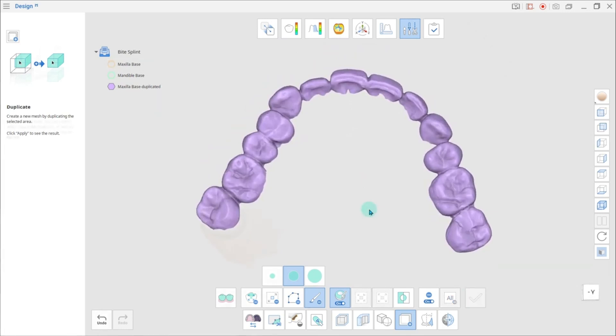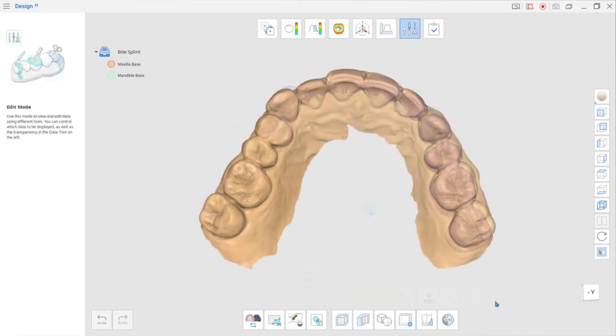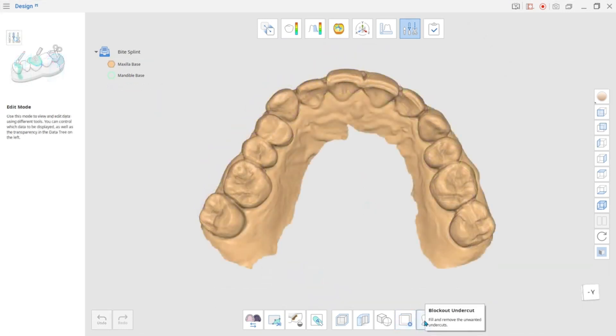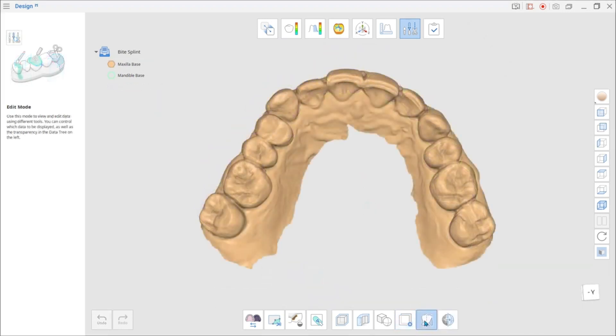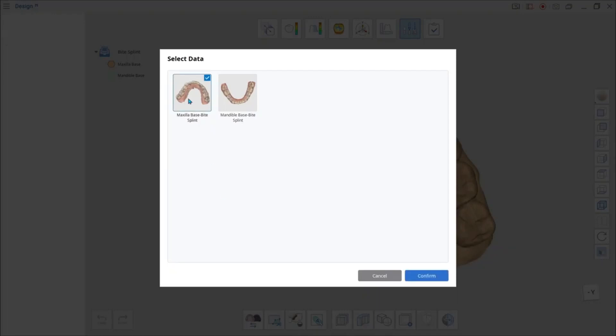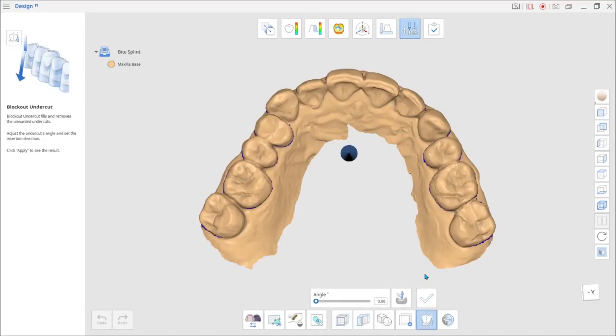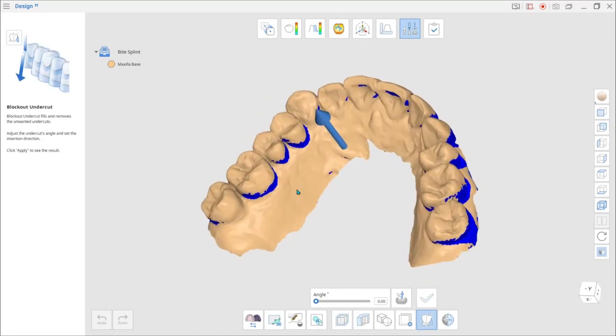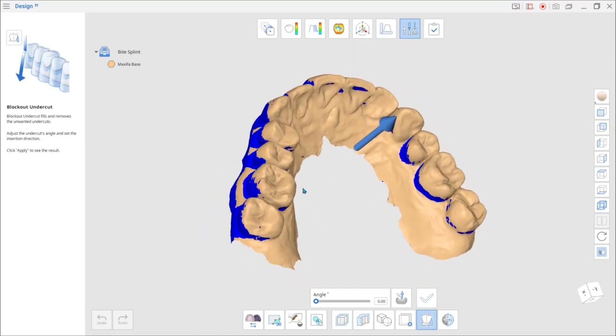Block out Undercut as another new tool in the app. You can adjust the block out Undercut according to the insertion direction. The blue arrow shows the insertion direction.